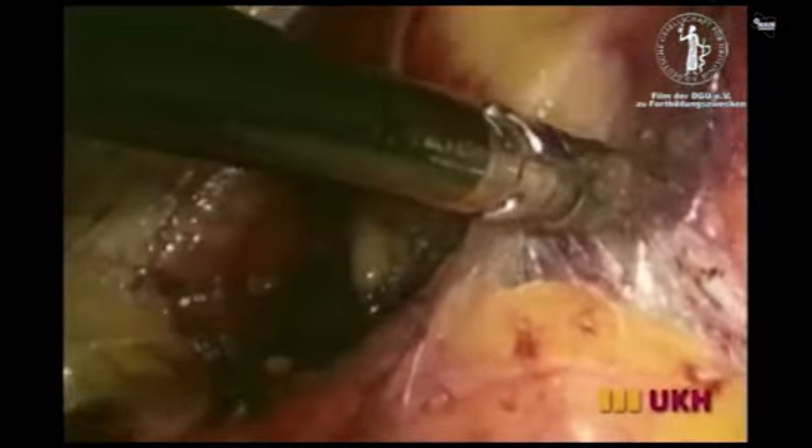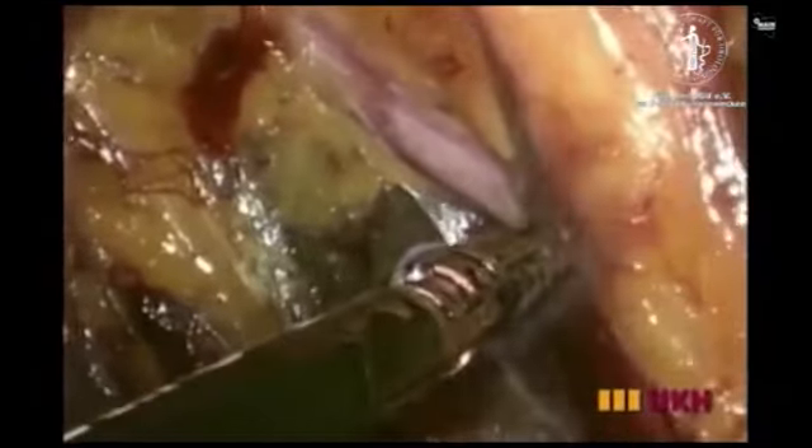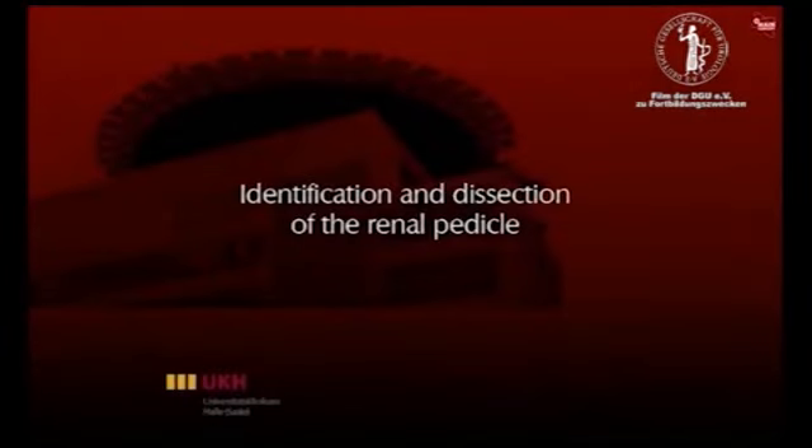During a laparoscopic single-site radical nephrectomy, the sequence of steps is comparable to the standard laparoscopic radical nephrectomy technique. The middle portion of the ureter is identified medially to the psoas muscle. While mobilizing the ureter, the small vessels are sealed by a ligature system. Gerota's fascia is now opened. Using a laparoscopic ligature system to reduce blood loss from the renal fat, the lower pole of the kidney is mobilized.